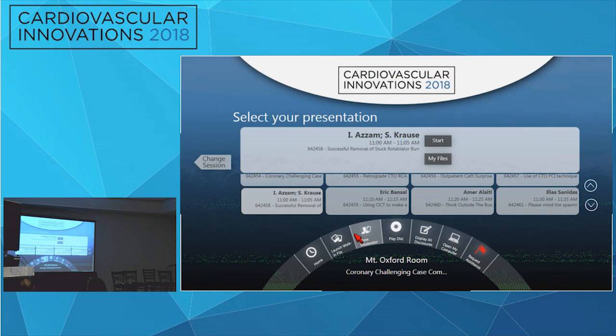It's always when you use a 6 French guide. The reason is because the 1.25 back end is flat, as opposed to the 1.5 which is baseball. That was literally the last time I used a 1.25, and this was years ago. I use only the 1.5 for most, like 99% of my cases, and then I will upsize to 1.75.